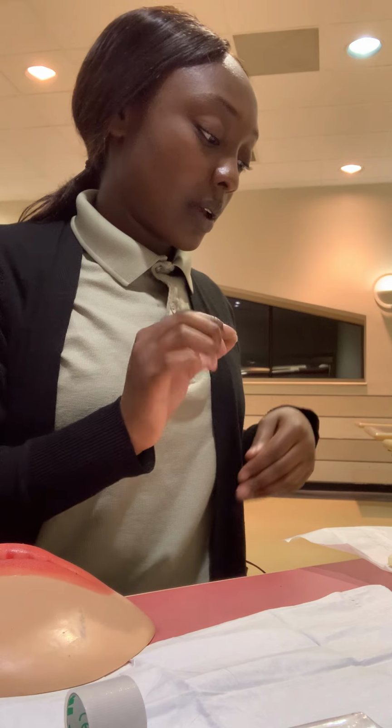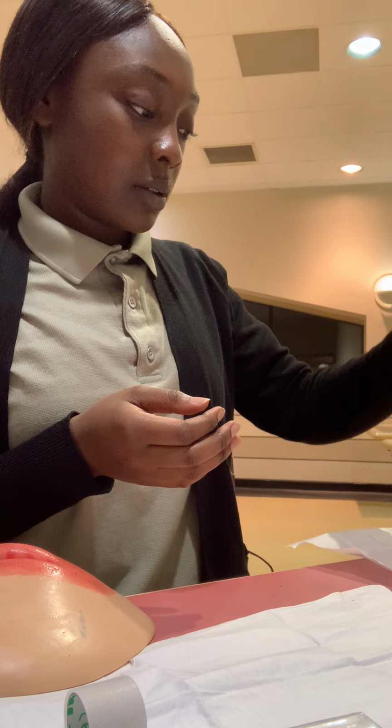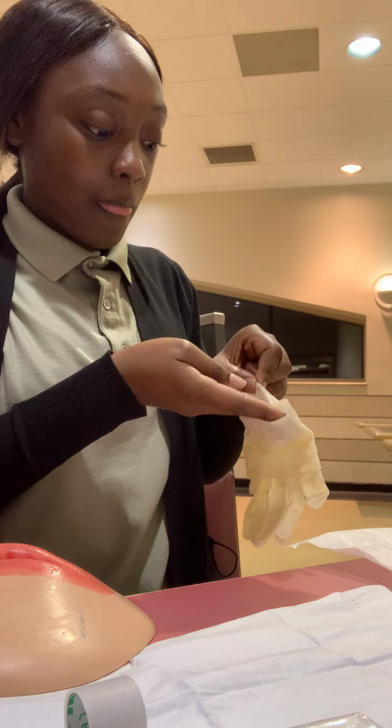I'm going to go ahead and glove my dominant hand by simply pinching, and I did not touch the sterile side of the glove.